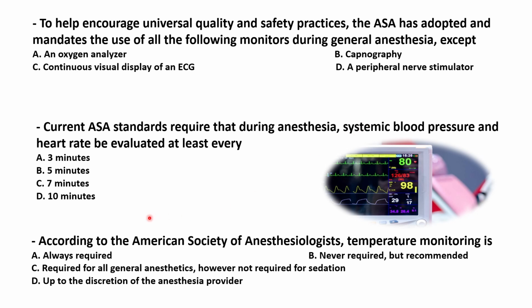Answer number B. According to the American Society of Anesthesiologists, temperature monitoring is always required? No, only when there is a significant change in temperature. Never required but recommended? No, it's a mandatory device. Required for all general anesthetics, however not required for sedation? No, when there is a change anticipated, intended, or suspected. Up to the discretion of the anesthesia provider. This is the correct answer when you are having a suspicion regarding a significant temperature change. This is about your own experience.